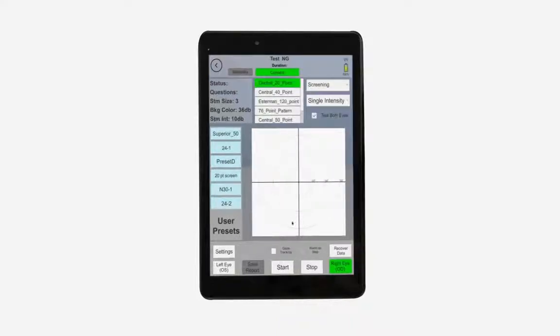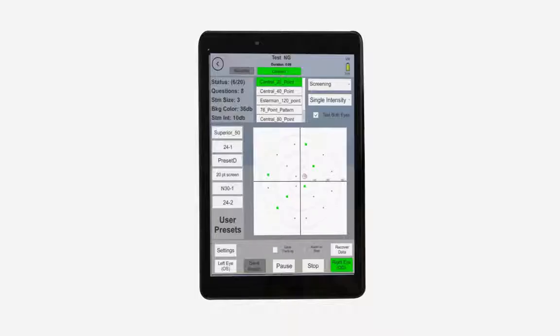For you or a staff member to operate the device, it's as simple as selecting the test and pressing start. The VF2000 will run its analysis on both eyes separately, generating an easy-to-understand report that you can watch in real time.